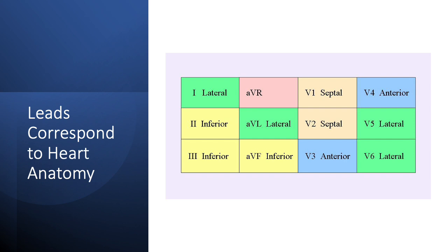It can help to identify an area that may be the source of a lesion for an MI that's in an area that's not typical, or it could also be utilized to help identify an area where an arrhythmia may be generated.